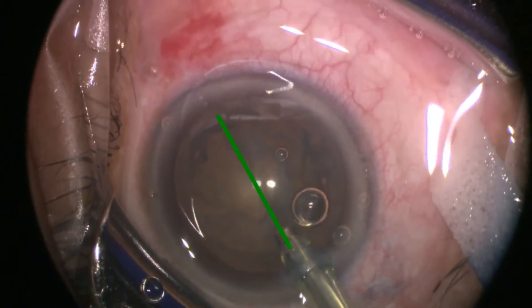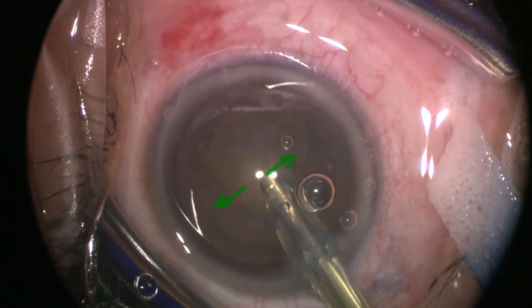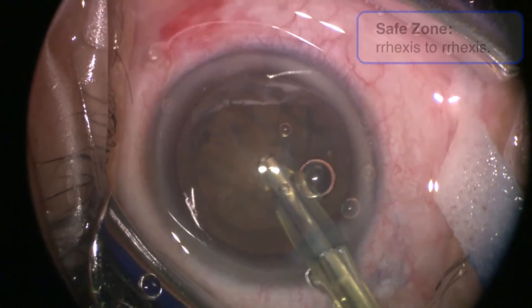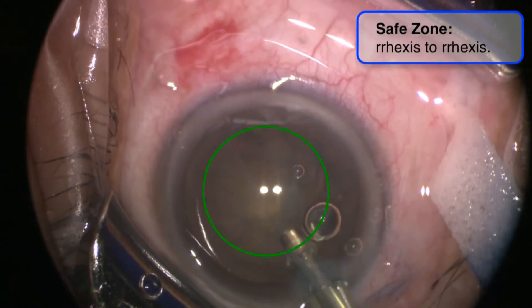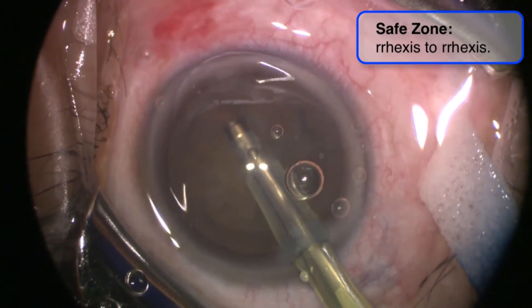The aim of grooving is to split the lens into two heminuclei that are approximately equal in size. As you are starting grooving, keep in mind that you have a safe zone that you should not extend beyond. The borders of this zone lie within the edges of your capsulorrhexis.